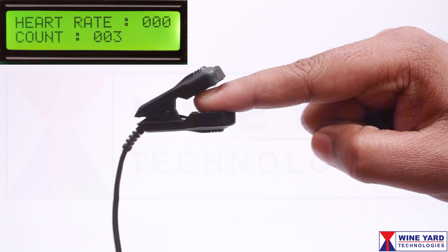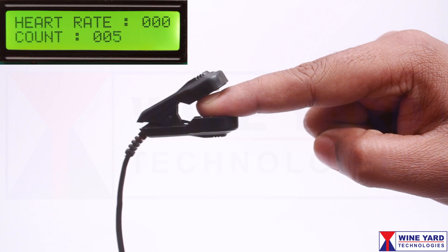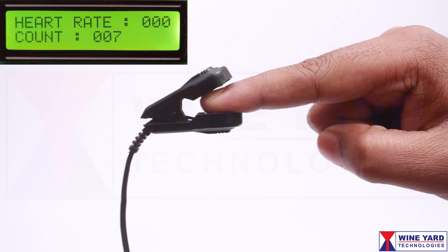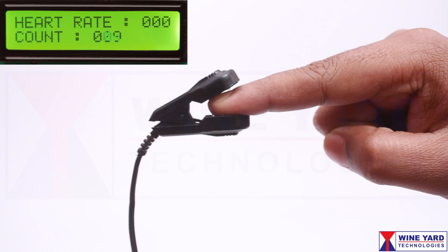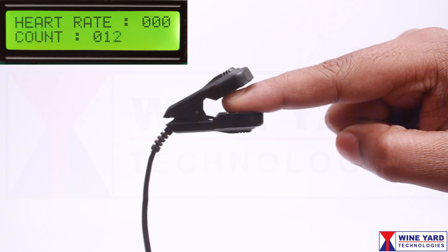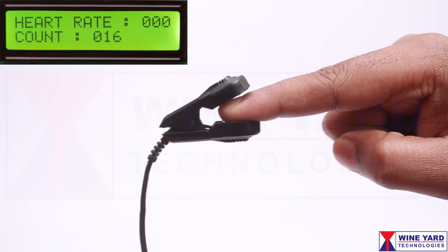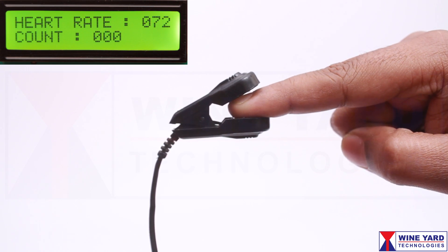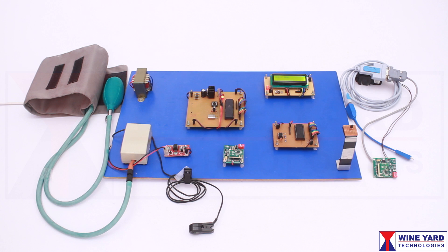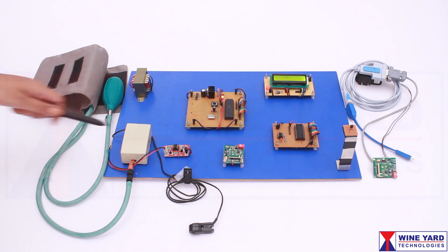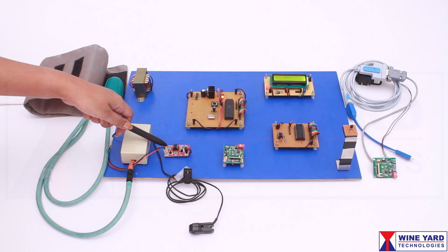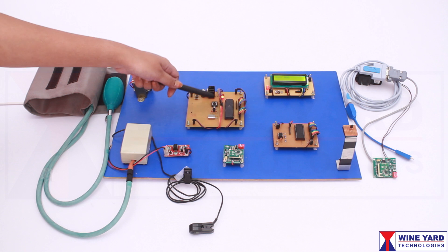This IR transmitter and receiver detects the change in blood volume of your finger artery while your heart is pumping the blood. In this way, your heartbeat is counted by the microcontroller.